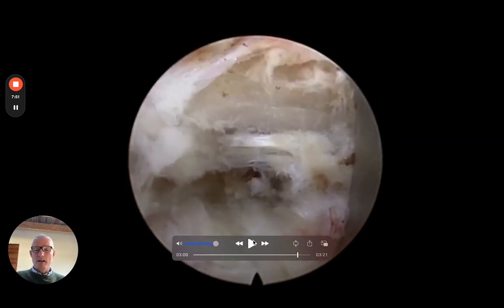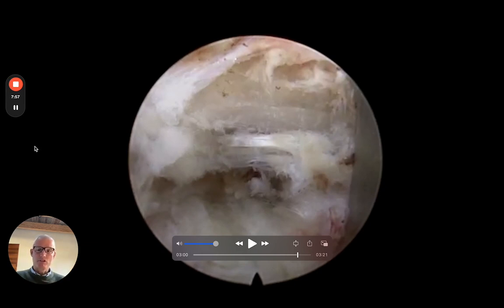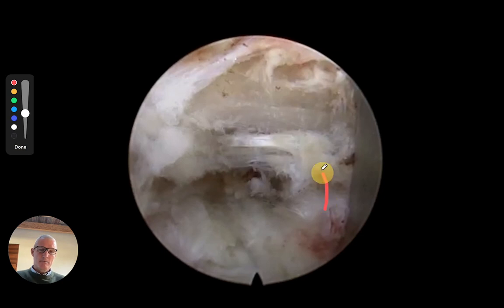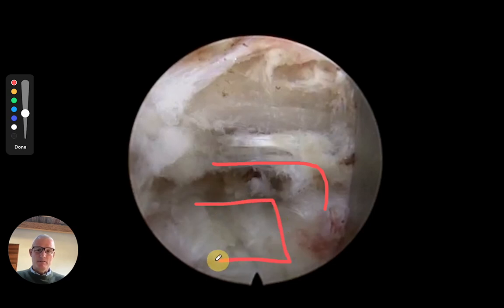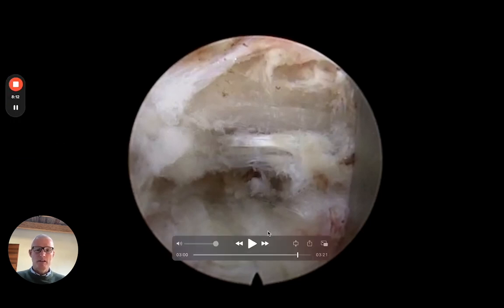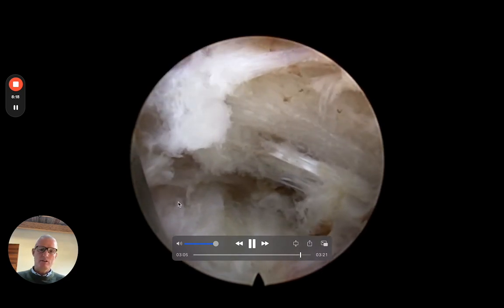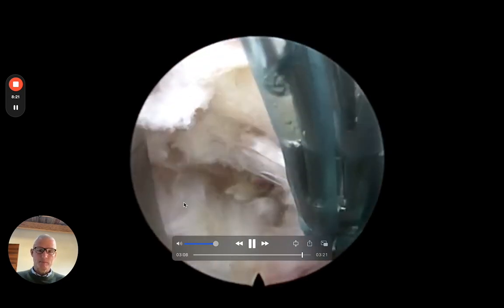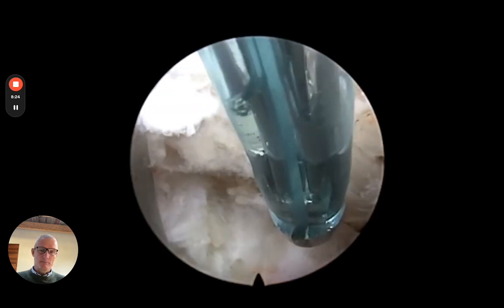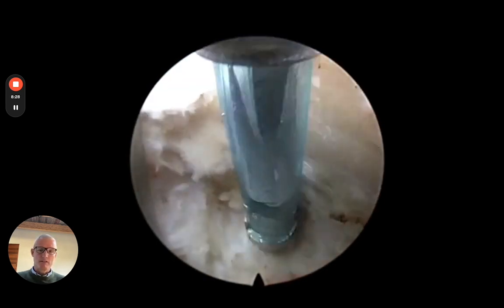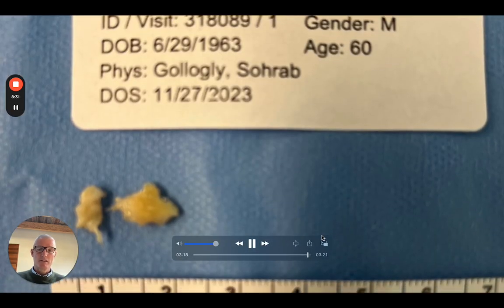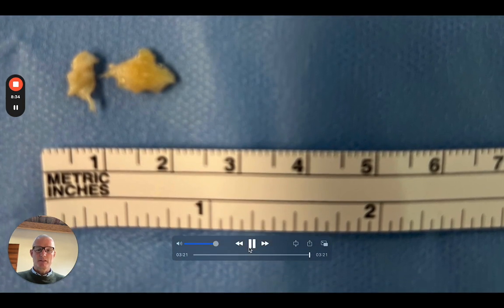There's the major fragment of disc material. This is what it looks like now that we've rotated back from our inverted position to the normal upright position. Here we can appreciate the pedicle and Wagner's arch, and we can see the undersurface of the superior articular process. This is now the remnants of the annulus that have been decompressed so that we can see everything appropriately once the disc herniation has been taken out. We can rotate the camera back and forth to visualize the area where the exiting nerve root would be at the 3-4 level. A little bit of cleanup and palpation with the bipolar device to feel the top of the pedicle and appreciate Wagner's arch, and there are the fragments of disc material removed in this particular situation.